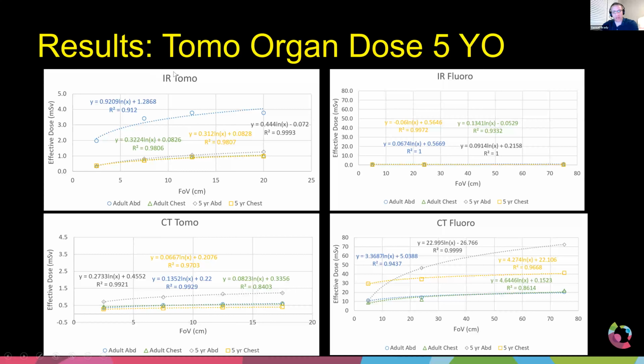And when you compare that to the actual CT itself, so doing just a normal helical CT of the chest or the abdomen, you can see that they were mostly the same, but a little bit lower than the cone beam CT from the C-arm. So cone beam CT, for all intents and purposes, used to be much higher dose several years ago than taking the patient down to a normal CT and doing your biopsies there. That's mostly changed, at least on the system that we tested, and I think it's true for most systems as we've looked at this.